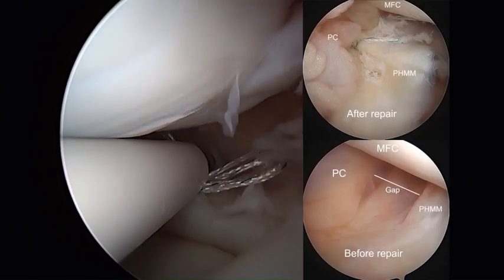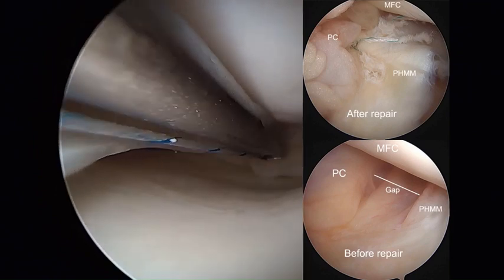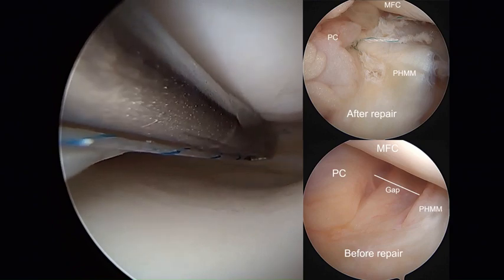The surgeon can observe the closure of the gap during suture tightening. The right lower picture shows the meniscocapsular gap before the repair of the ramp lesion. The upper picture shows the gap has closed after repair of meniscocapsular ligament.